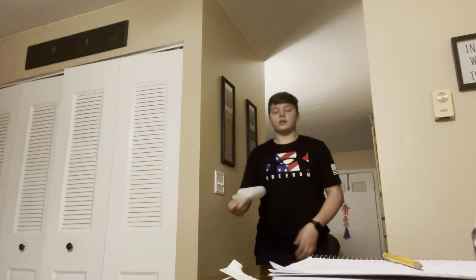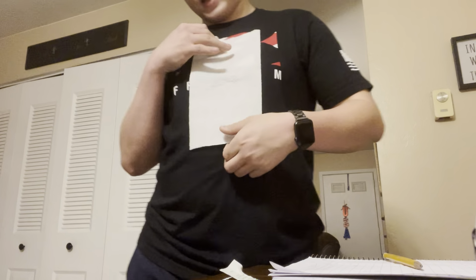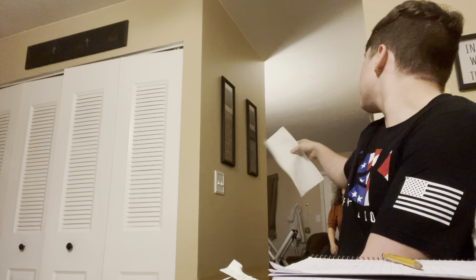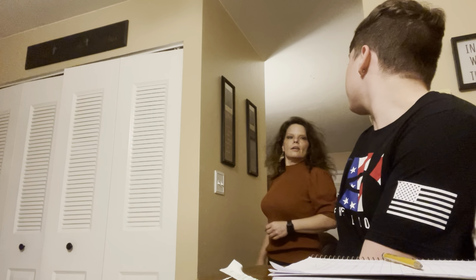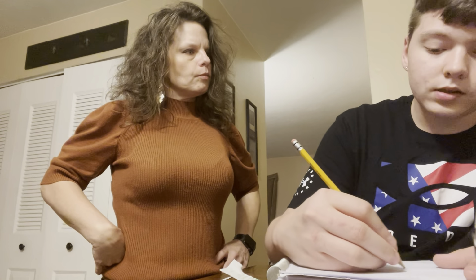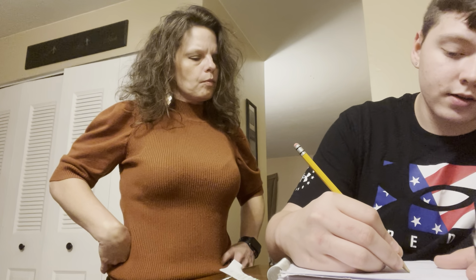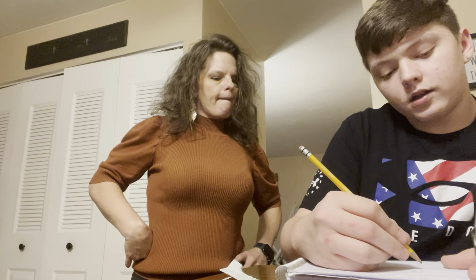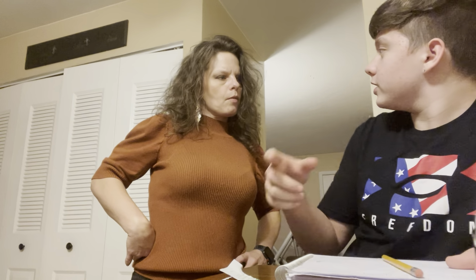So it comes out to exactly, these are exactly 12 inches, as long as a foot-long ruler. So I did it like that, and it came to exactly 5 foot. And that's exactly what my mom was. So, we had the pulse, which was 64. We have your height, which was exactly 5 foot. Then we have her weight, oh yeah, we're going to do your weight.